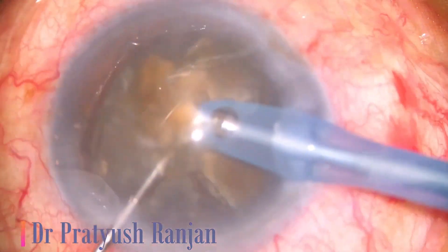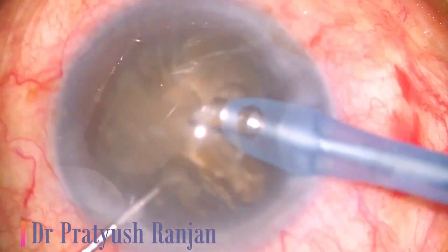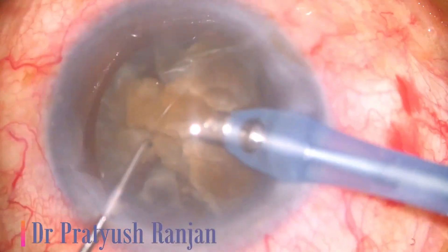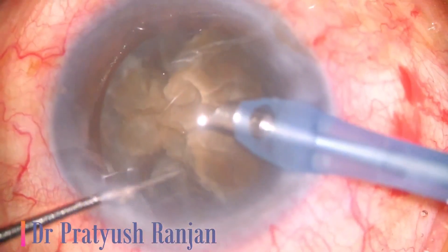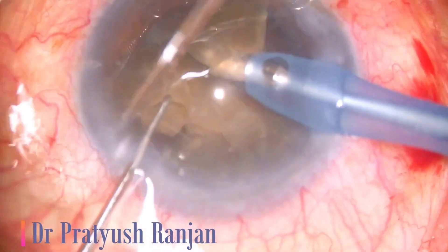This emulsification is going on in the bag. You're not near the capsule — you're in mid-bag or just at the pupillary plane level. So that makes you safe.